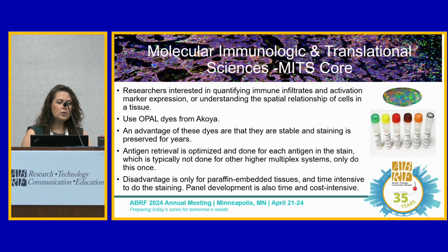We use Opal dyes from Akoya to visualize antigens on our tissues, and an advantage of these dyes in particular is that they're stable, and their staining can be preserved for years, especially if you store your slides in the refrigerator or in the freezer. So you can go back and image these slides later on if you need to.